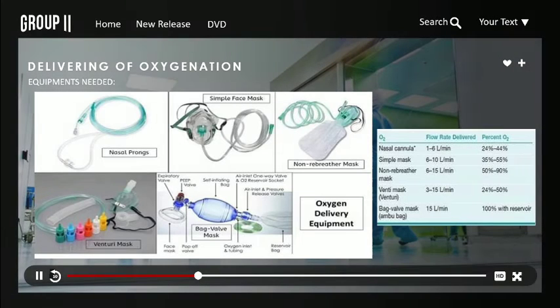For delivering of oxygenation, the equipment needed are nasal prongs, simple face mask, non-rebreather mask, the Venturi mask, and the bag valve mask.